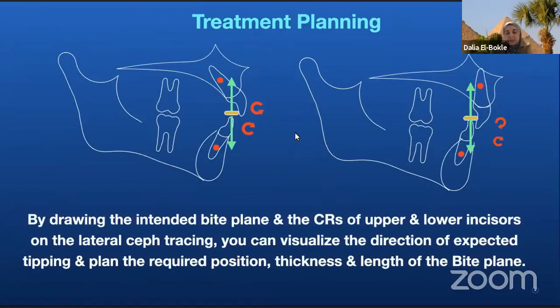And here is how I do it during the treatment planning stage, by drawing the intended bite turbo, the center of resistance, where the forces are going to be dissipated, and how the teeth will move.